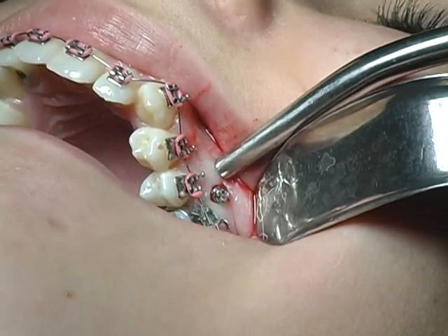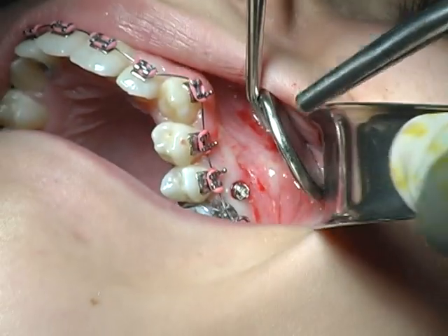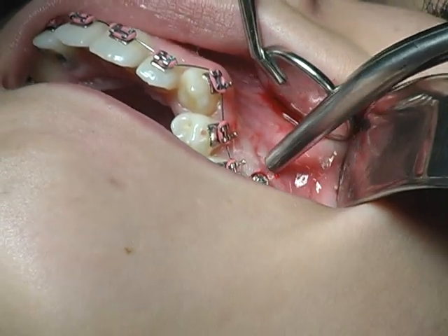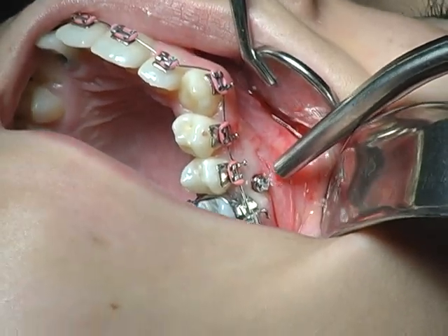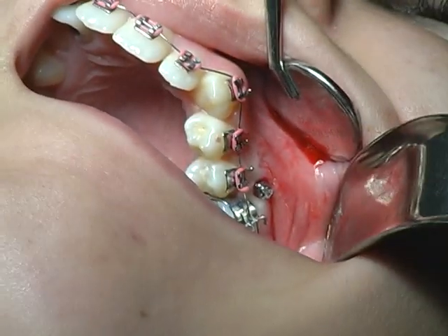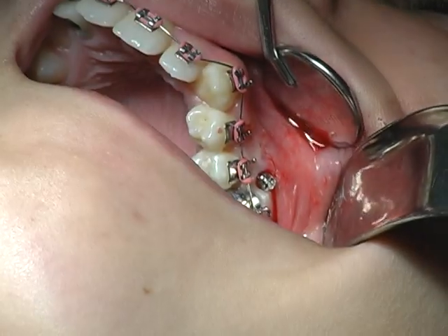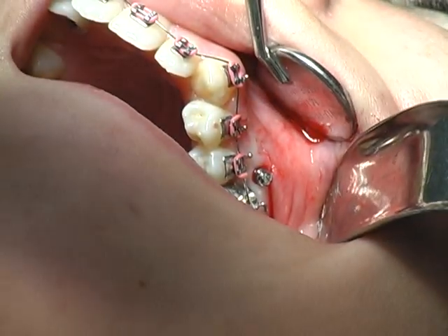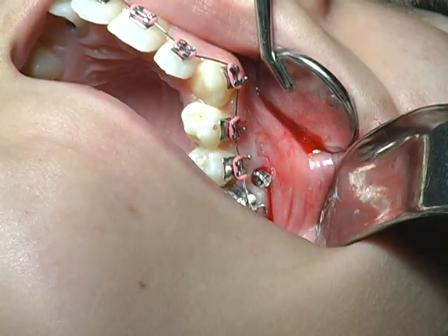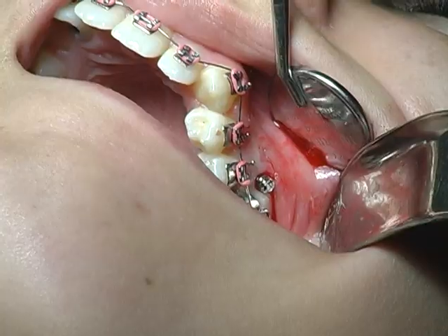Now everything is in there. You can see the pin. Turn your head a little bit — and there you can see the pin in the right position to do the job. Now we leave it like this, and then the orthodontist does the stabilization wire and fixation. And that's it — that was the whole procedure. Thank you very much.